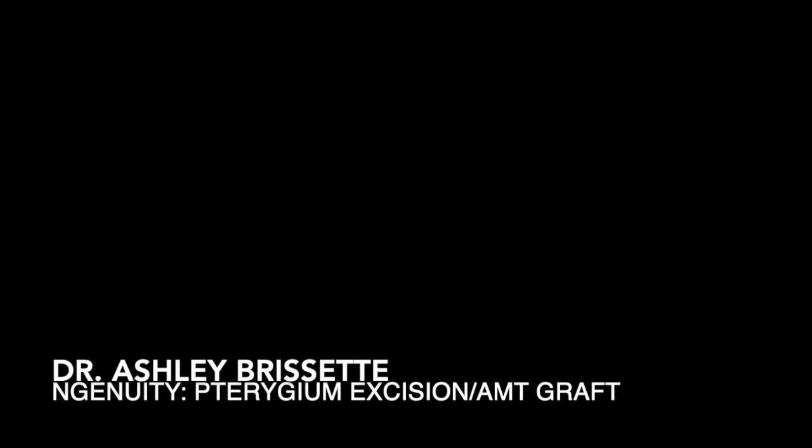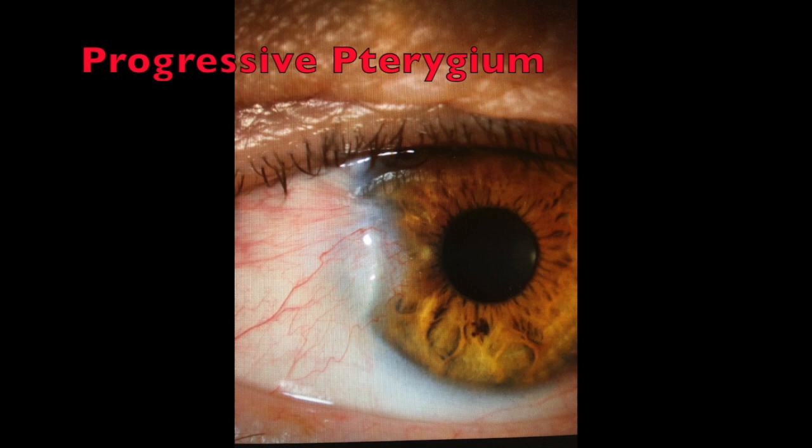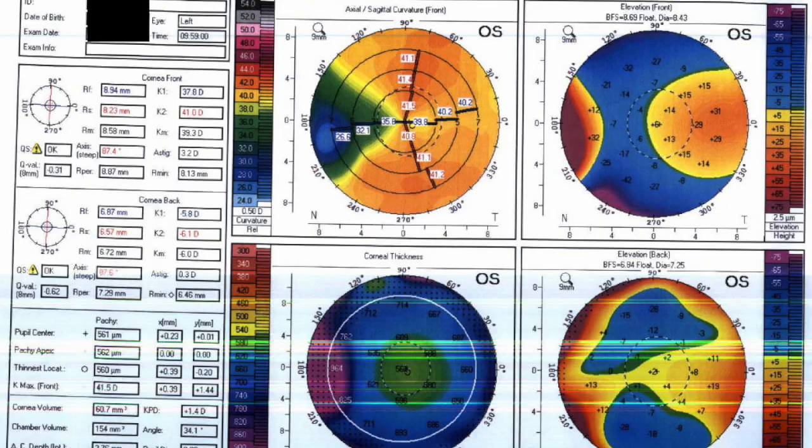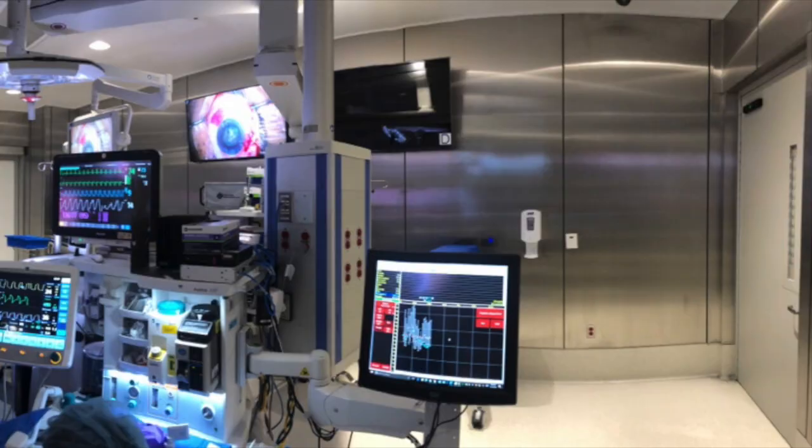This is Dr. Ashley Brissett showing a pterygium excision with amniotic membrane graft. This patient had a progressive pterygium which was causing irregular corneal astigmatism and affecting the visual quality.